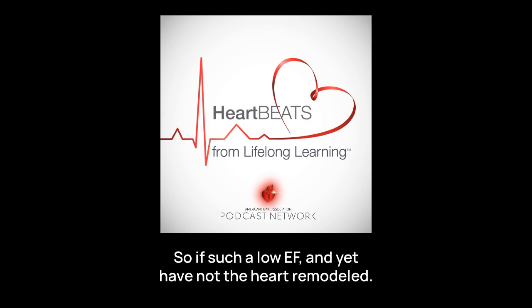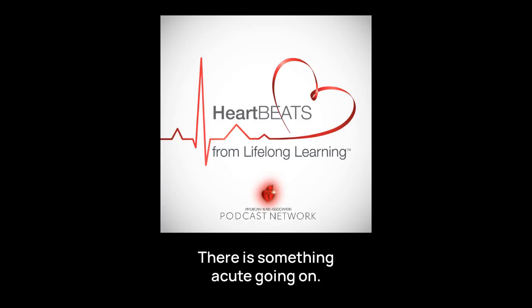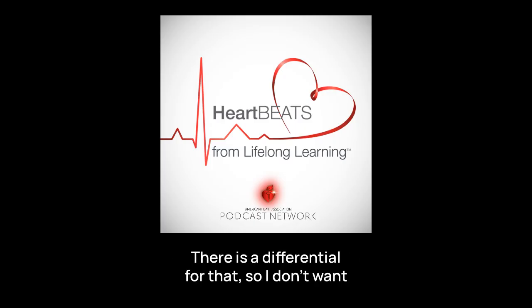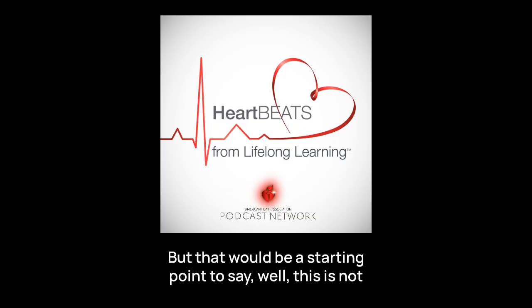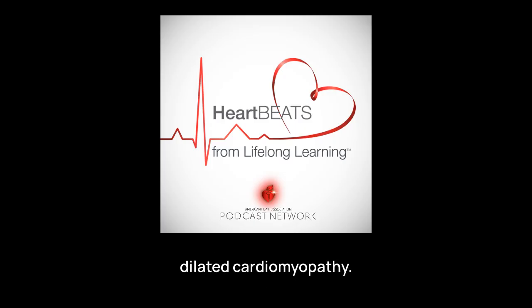So if there is such a low EF and yet the heart has not remodeled, there is something acute going on. There is a differential for that. So I don't want people to think that you're done, that's myocarditis. But that would be a starting point to say, well, this is not dilated cardiomyopathy.